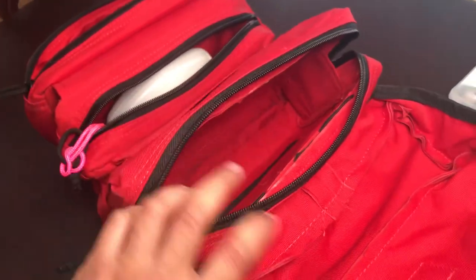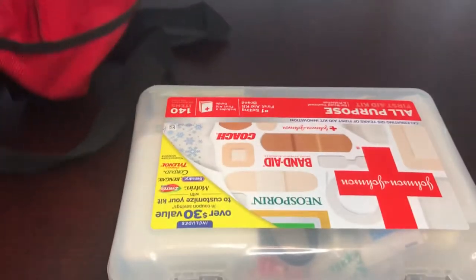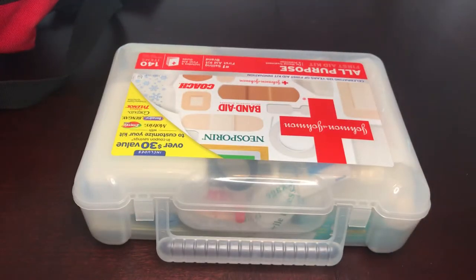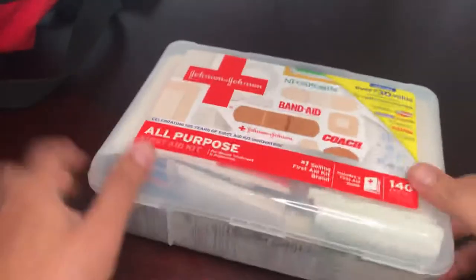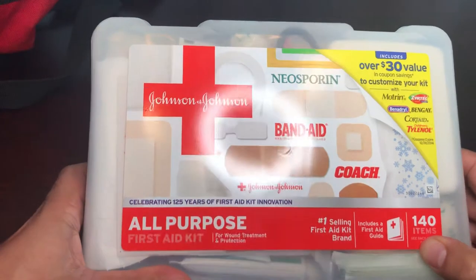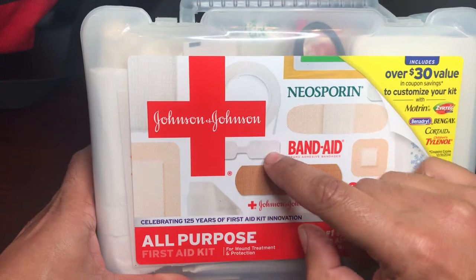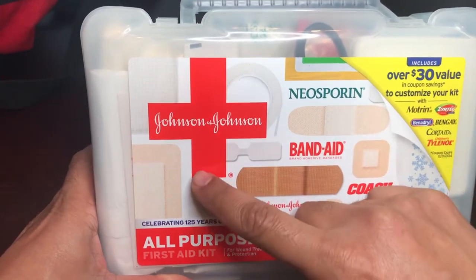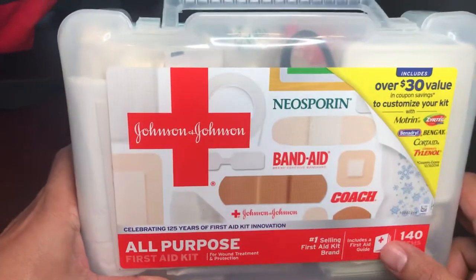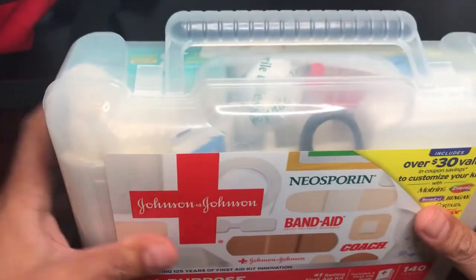I took the box out because it's a tight fit. This is an inexpensive $10 Johnson & Johnson first aid box. It comes with band-aids — butterfly band-aids, regular ones, square ones — a little bit of gauze, and some medical tape. But mostly it's full of band-aids.